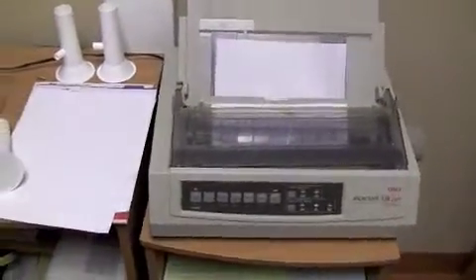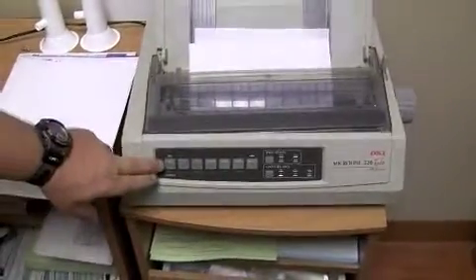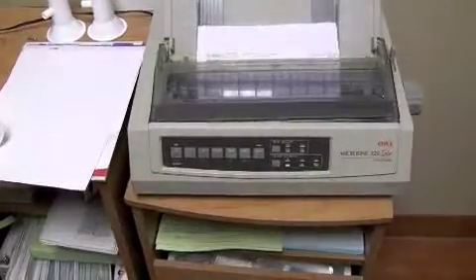Remember, on the printer you have to get that leftmost button pressed, otherwise the information does not get sent.